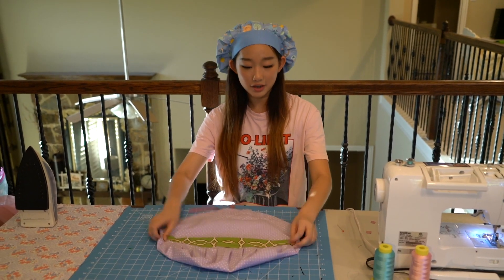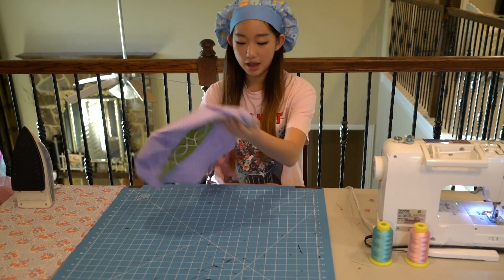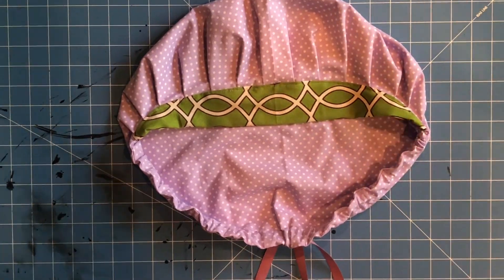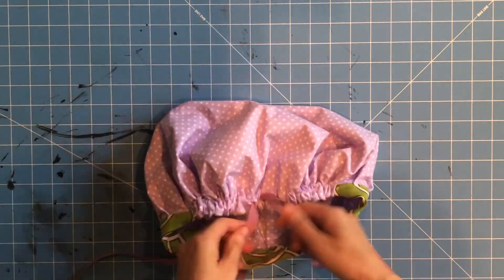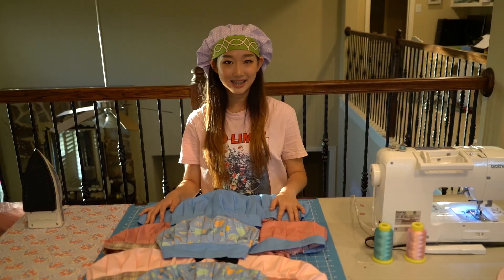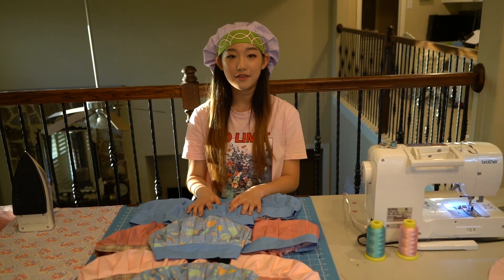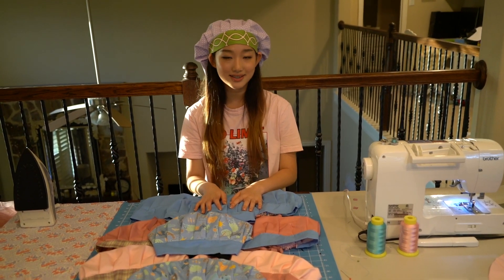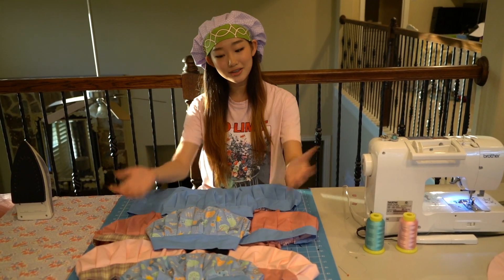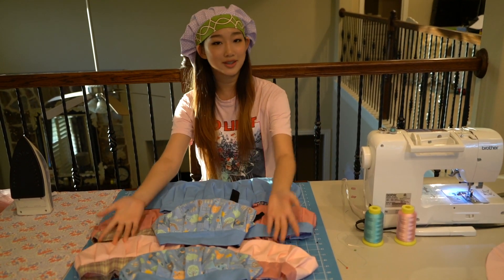We finally finished the cap! The band is attached in front and the laces in the back — just pull on the laces and it comes together so you can tie it on top of your head. Once you get the hang of it, each hat takes about 45 minutes to an hour to make. You can have fun with the patterns too — like this animal print, or use solid colors. Happy sewing and stay safe!